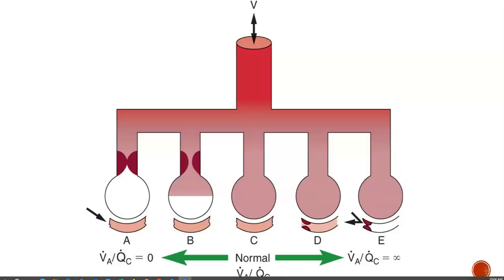So when we have artificial airways in place, those functions get bypassed, right? Because we're not breathing on our own. We've got something down our throat breathing for us, pushing oxygen into us and giving us our breath. So we bypass that nasal cavity and that pharynx.